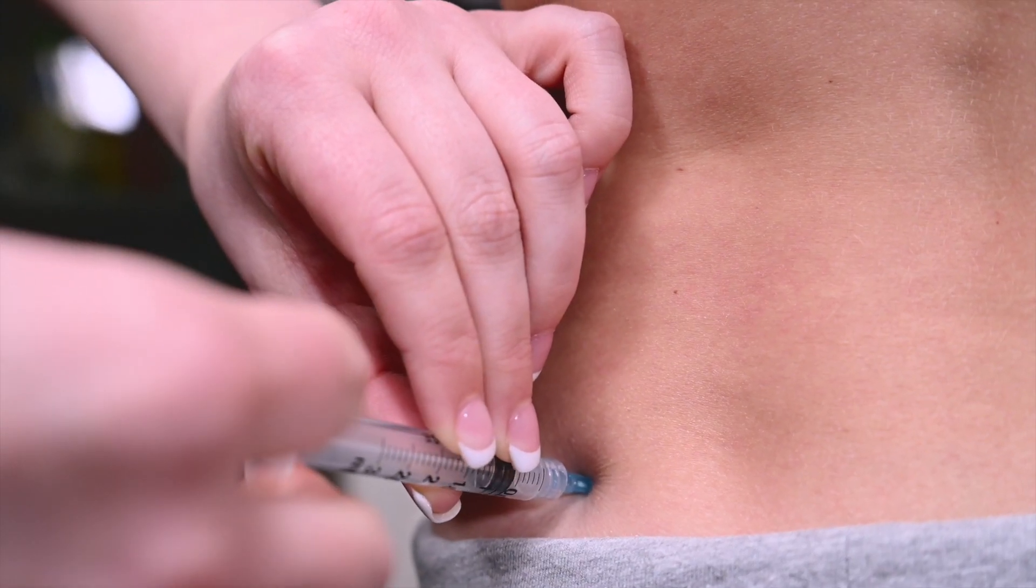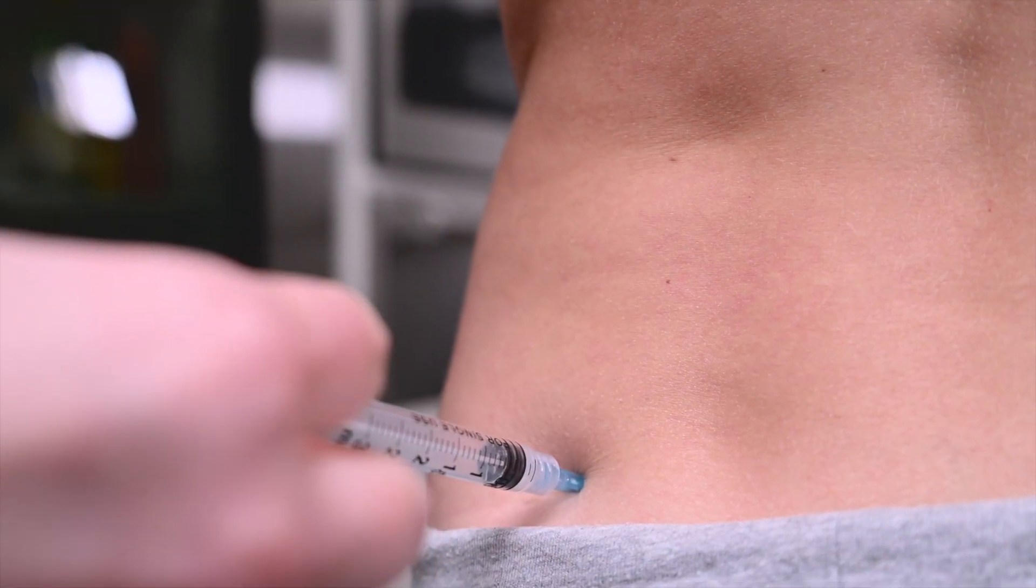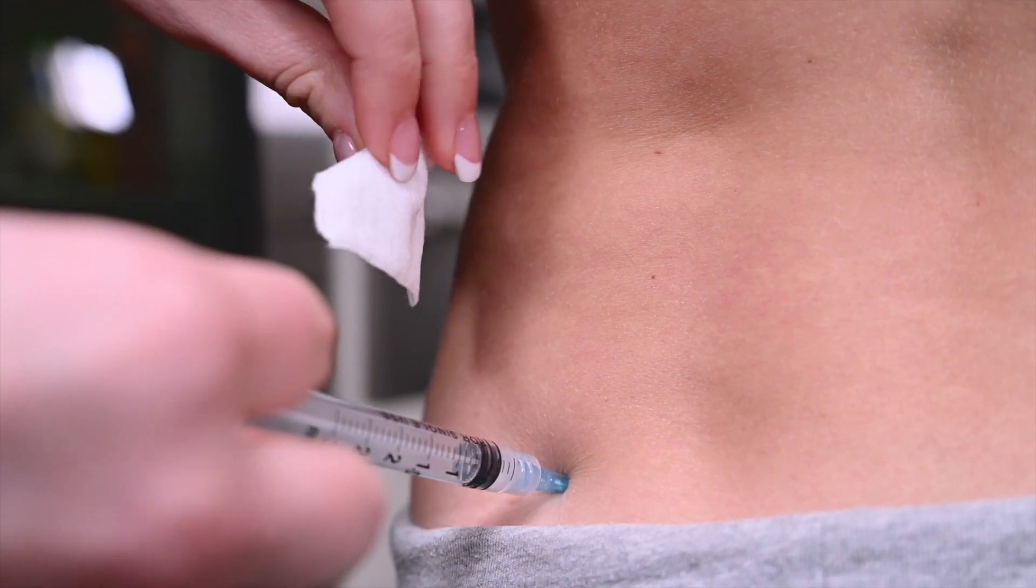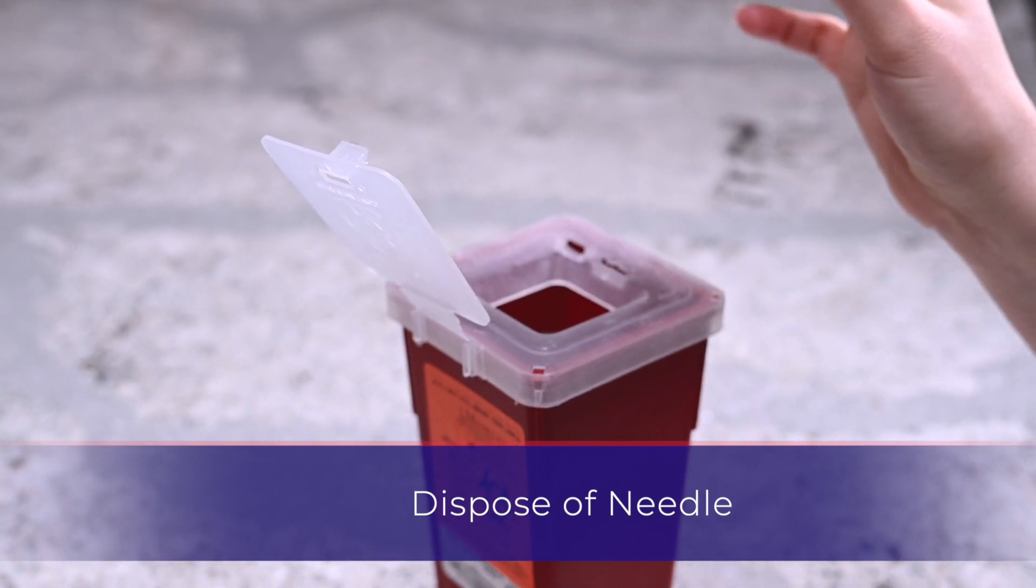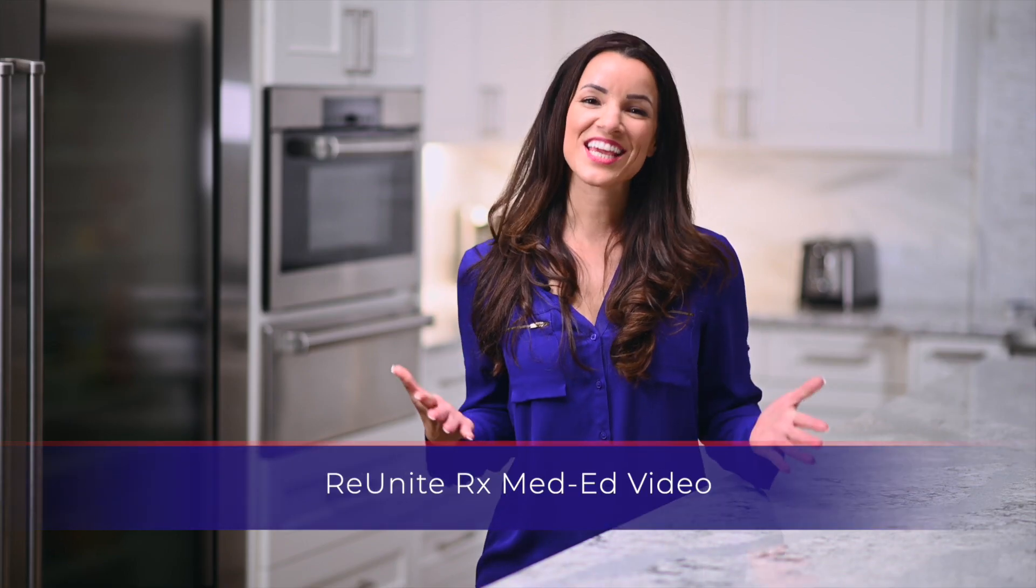Push the plunger until all the medication transfers into the injection site. Gently remove the needle and apply pressure with the gauze. Dispose of the used syringe into the designated sharps container.